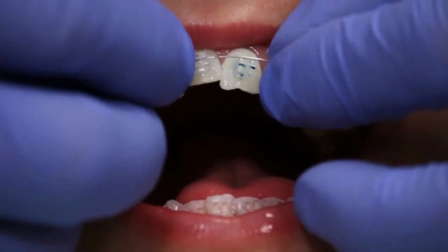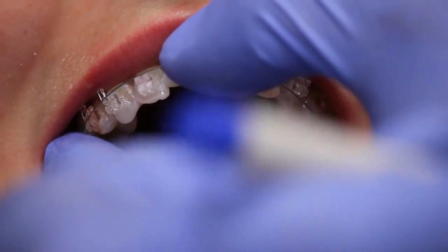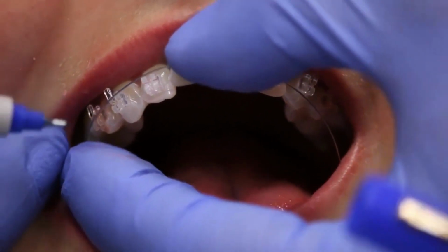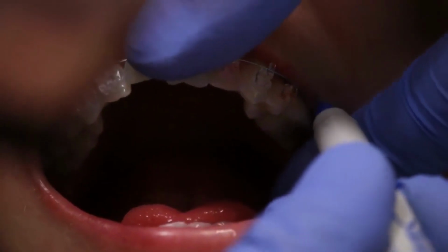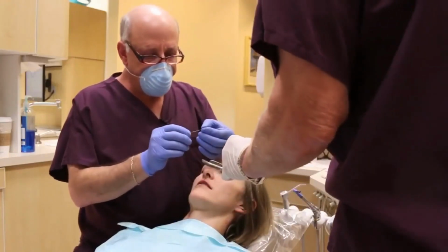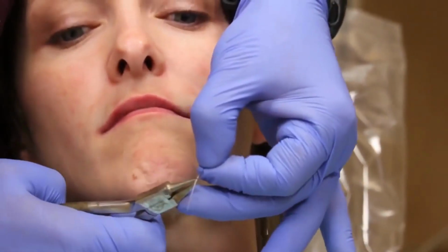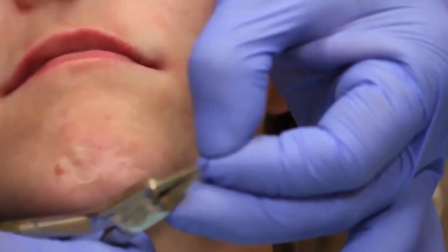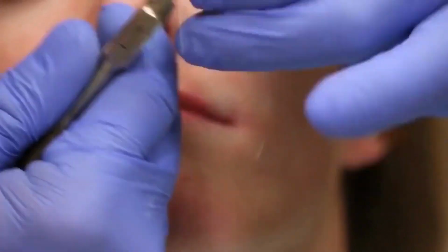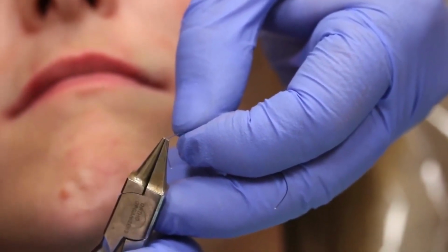And one of the things I'm going to do, I place the wire and I hold it with my fingers, and then with a Sharpie marker, I mark distal of the bracket of the bicuspid on both sides. So I can put a bend right distal of the bracket of the wire, and that will give patients some comfort. Now I have pulled the wire and I can see the dot right here where the plier is holding. So right at the dot, I would grab the wire and I would just turn. And you can see, even though this is nickel titanium, the wire undergoes permanent deformity.